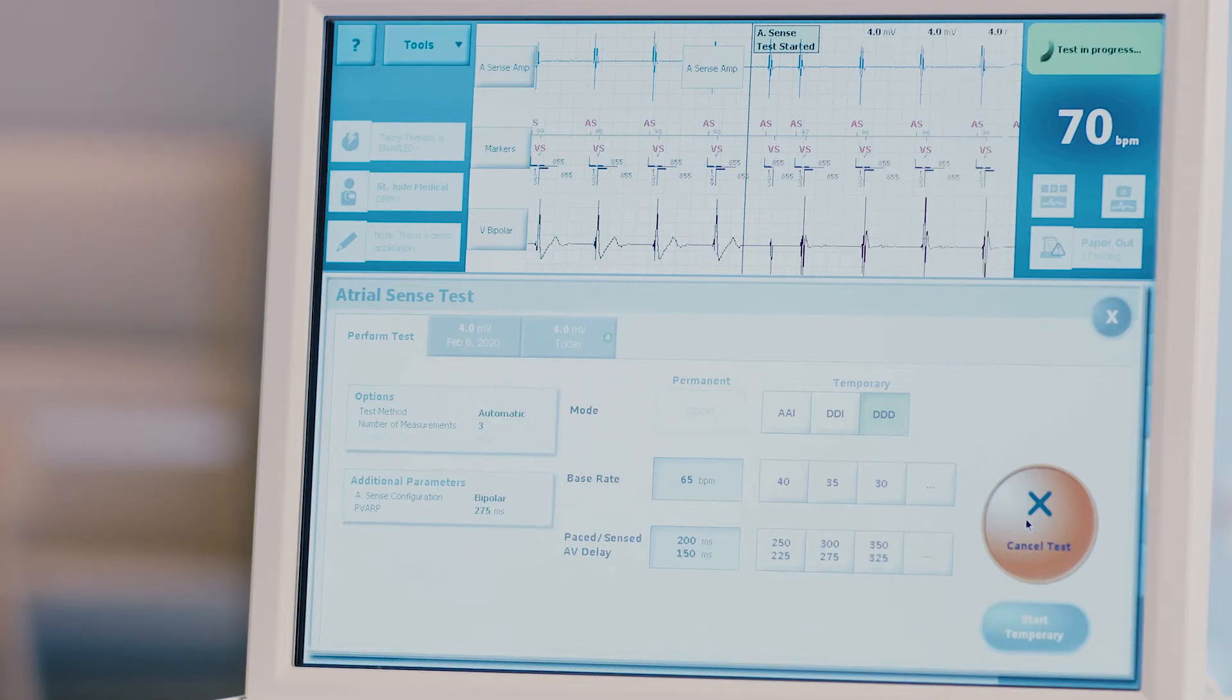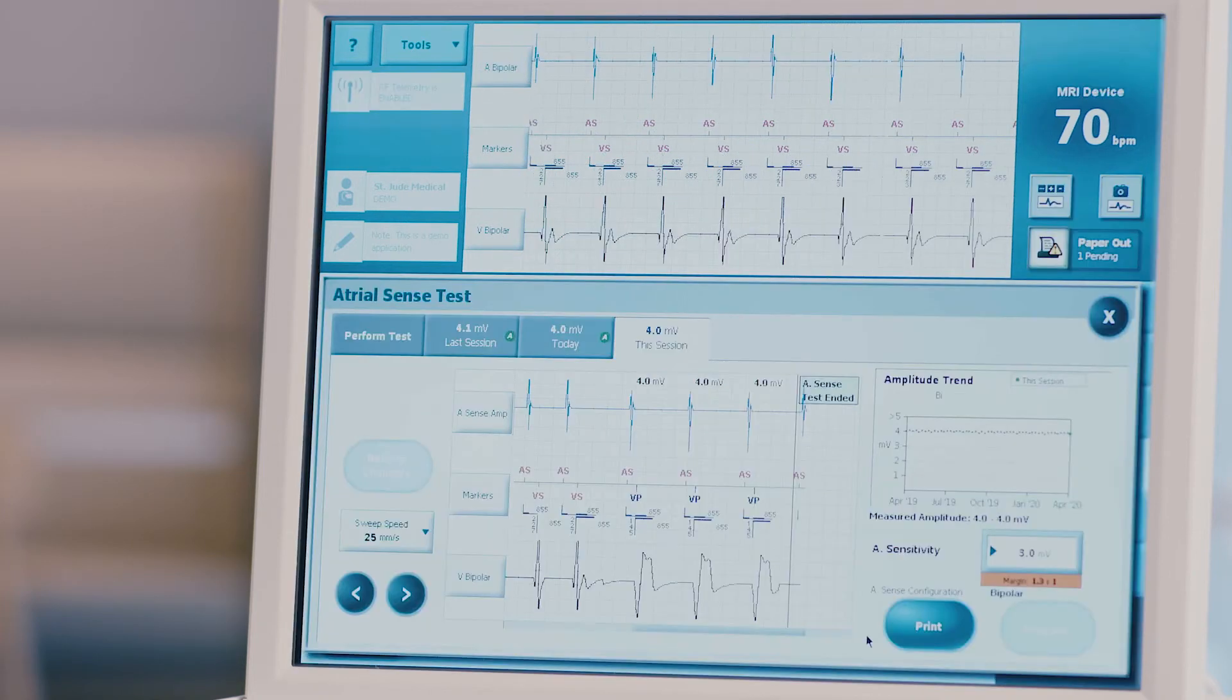For automatic testing, the test will end once the data point is collected. For manual testing, the test will end once you visually obtain the measurement and release the button. You can cancel a test at any time by pressing the yellow cancel test button. No data will be recorded.